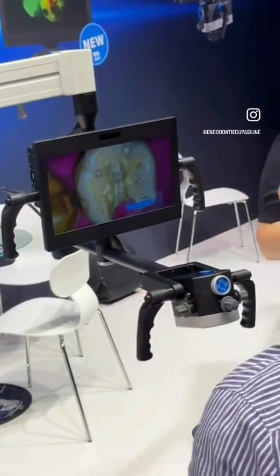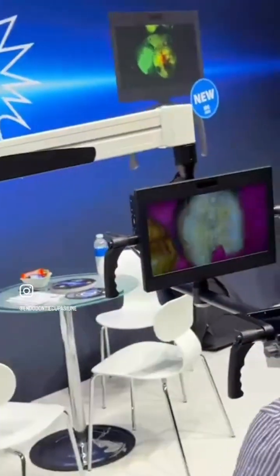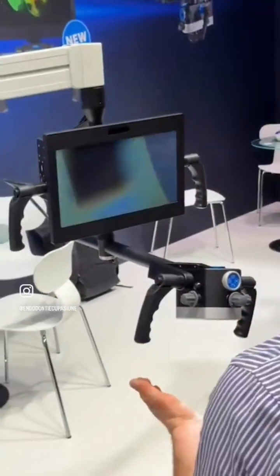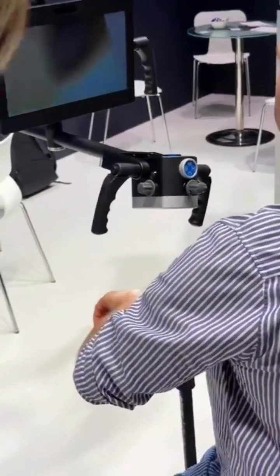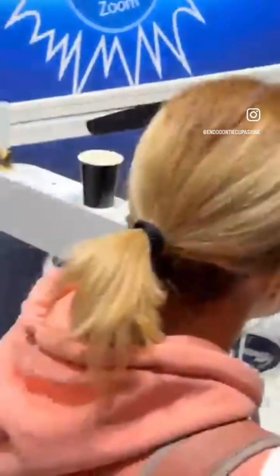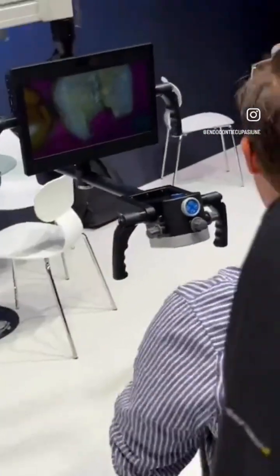Still, I believe the magnification is quite high enough to do proper endodontics. The field of view is really great, the movement is very smooth, and the microscope is very well balanced. The body is the same as with the Flexion, so there's nothing new to discuss there.